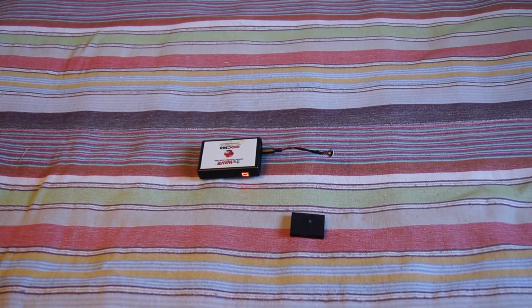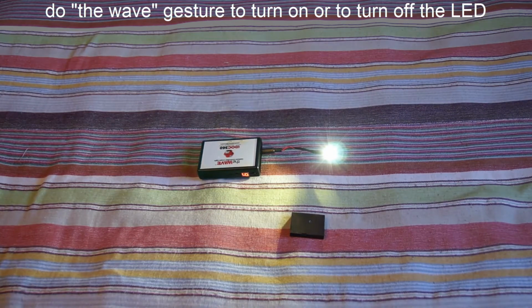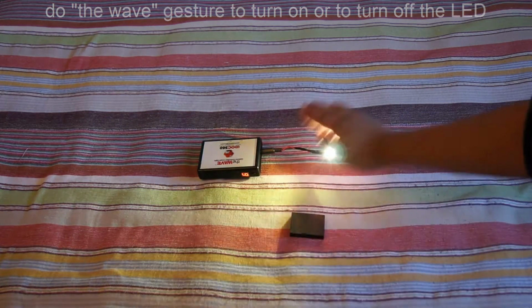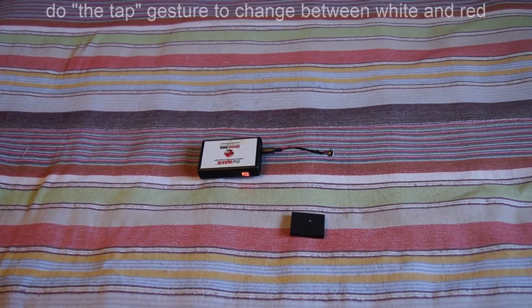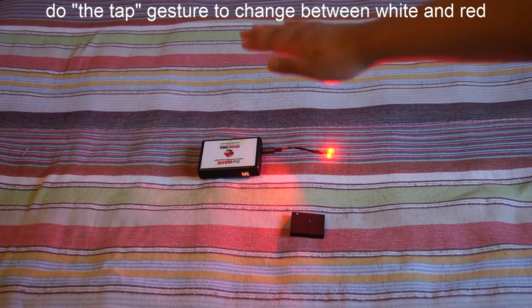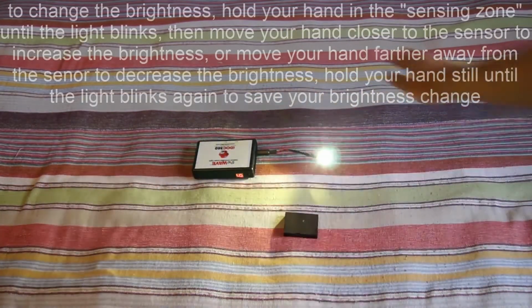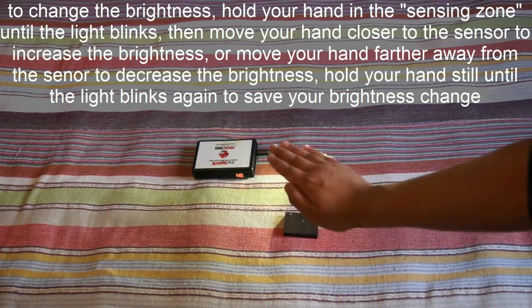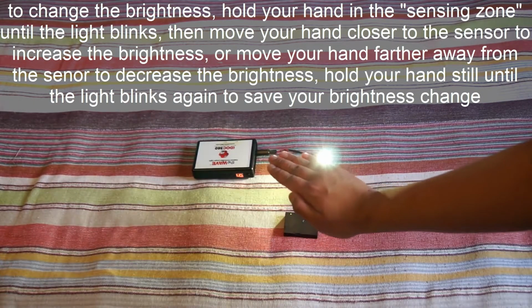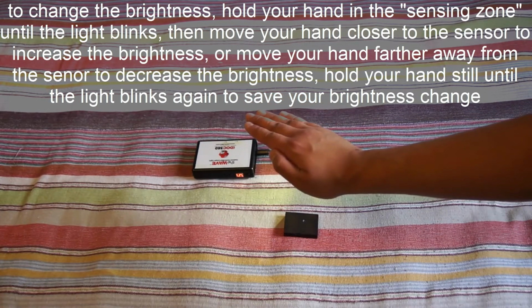So to turn on the LED, simply do the wave. To turn off the LED, do the wave again. And to change the color of the LED, do the tap gesture. To change the brightness, hold, adjust, and then hold still again.